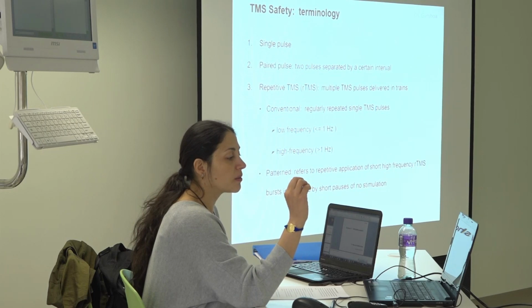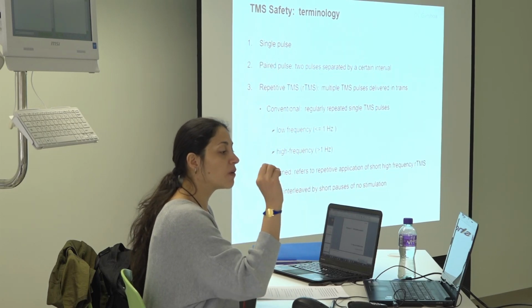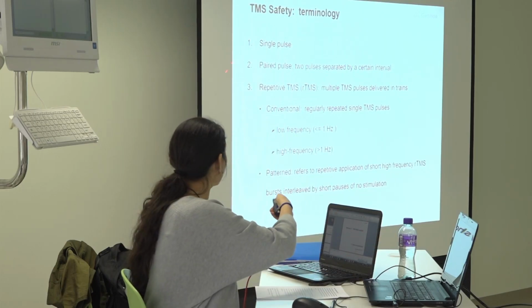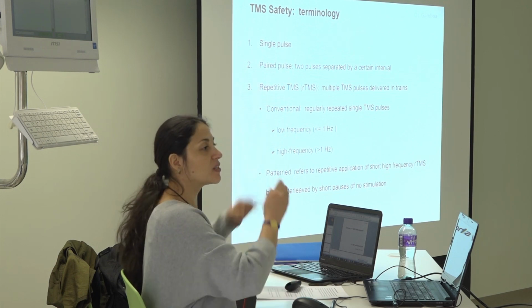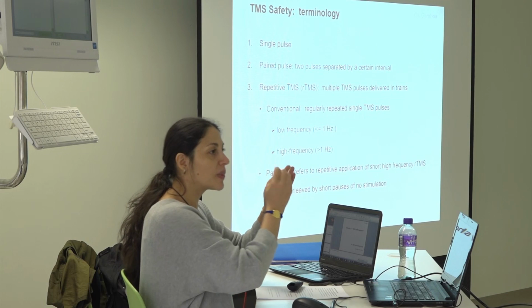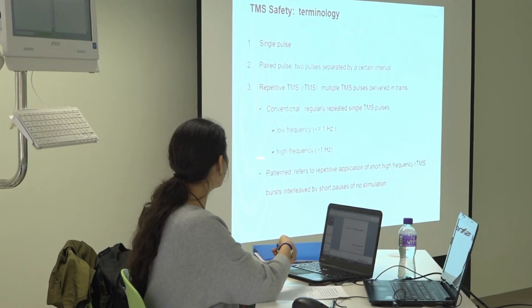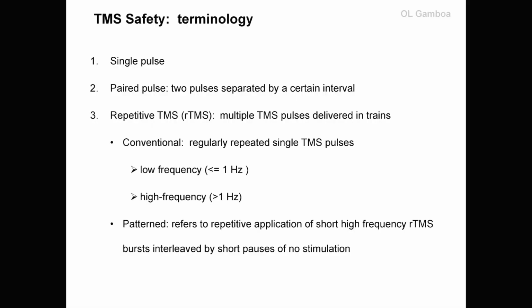And the pattern will be the repetitive application of short high frequency bursts, so mixing a little bit the high frequency part, but sending in short bursts, like in patterns. I send 3 blocks here, and then 8 seconds later, three blocks, and then 3, and something like that. It refers to repetitive application of short high frequency rTMS bursts interleaved by short pauses of no stimulation.